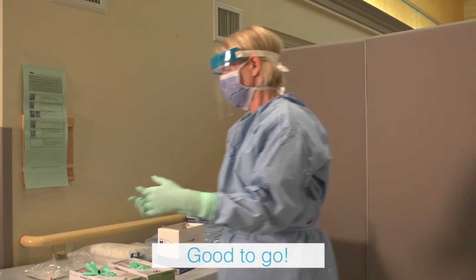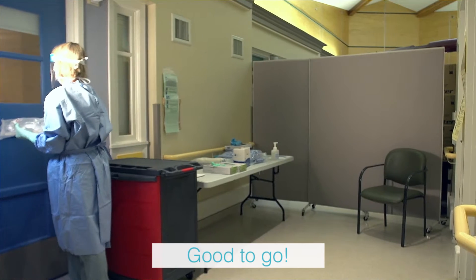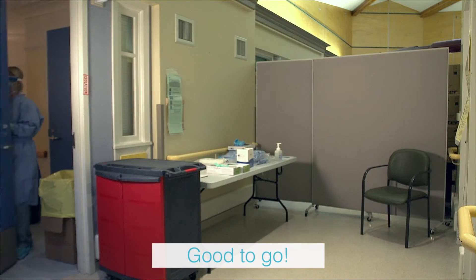You may now enter the room to care for your patient. Avoid touching your face or adjusting the PPE and minimize contact with contaminated surfaces.